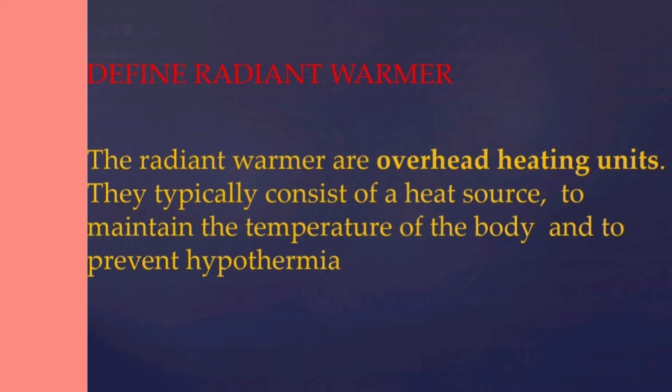Today I am going to discuss with you about radiant warmer. Radiant warmer is one of the heat therapies. It is given for the babies who are unable to maintain normal thermal regulation. So these babies are kept under the radiant warmer for maintaining thermoregulation.